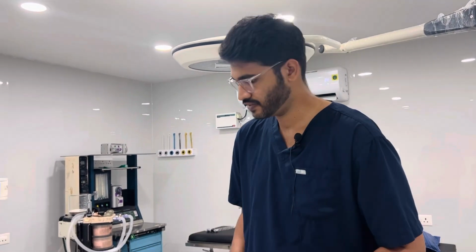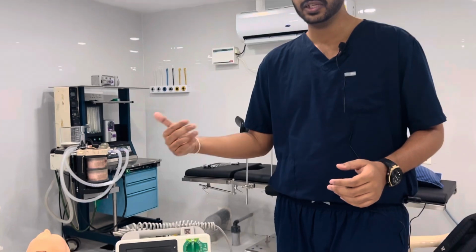Then the next question: what if you don't press the sync button and directly deliver the shock? It's very simple. The patient already has arrhythmias, and if you give the shock directly while he is in a refractory phase, it will go further and cause a cardiac arrest. So these are the complications if you don't press the sync button and give the shock.